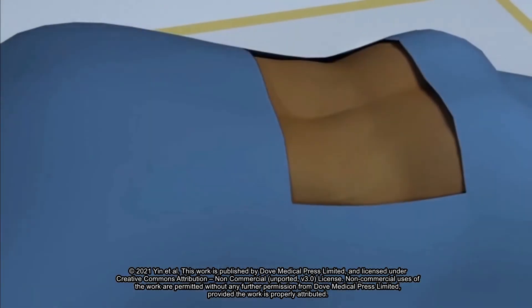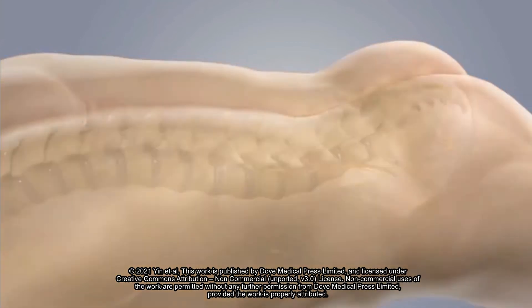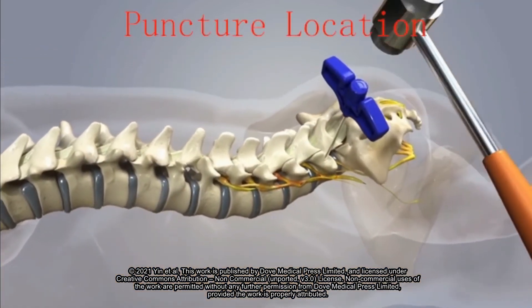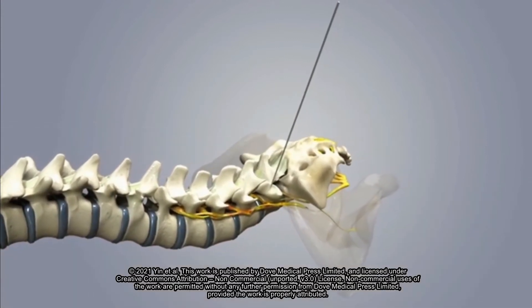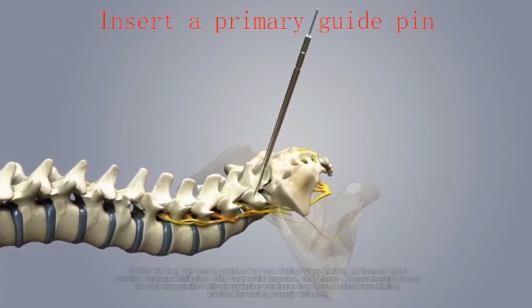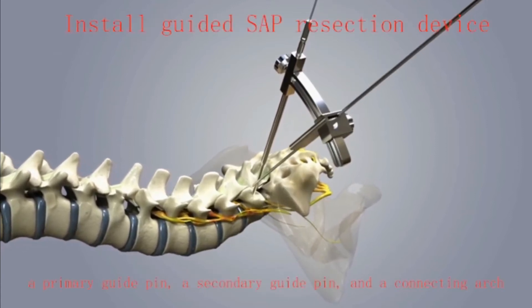Pedicles of two vertebral bodies adjacent to the lesion segment were identified by intraoperative C-arm fluoroscope. Under the guidance of the fluoroscope, the primary guide pins were inserted into pedicles on the symptomatic side. Connecting through the arch, a secondary guide pin was placed at the superior articular process.